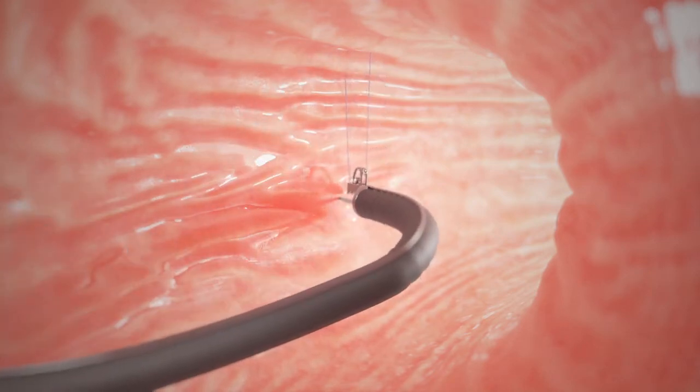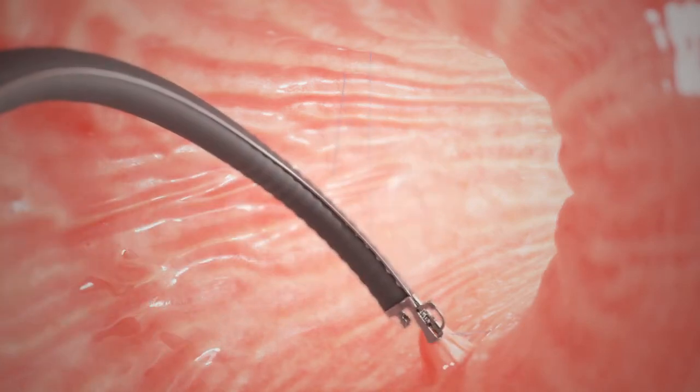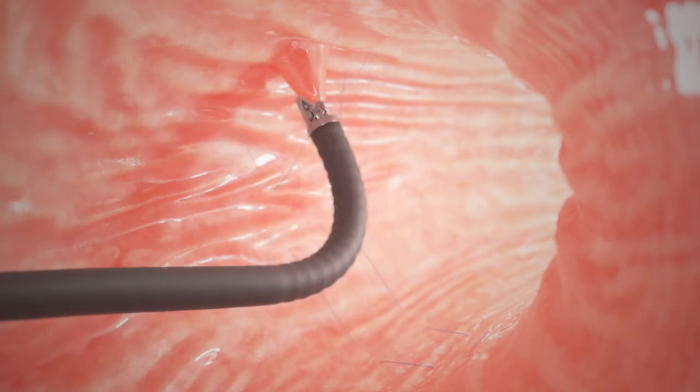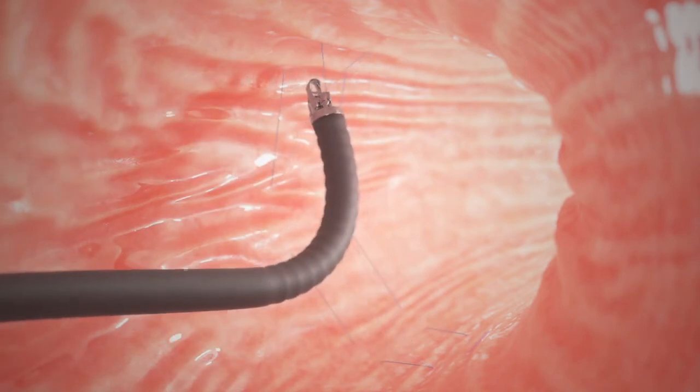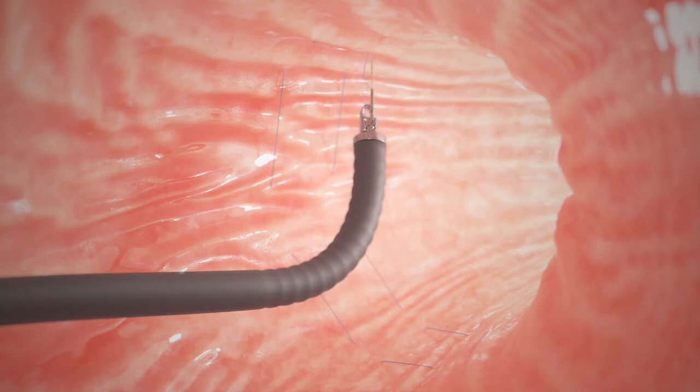The stitches or sutures are placed in a U-shaped pattern, starting near the bottom of your stomach and working towards the top. As each U is completed, the suture is tightened down to reduce the volume of the stomach.